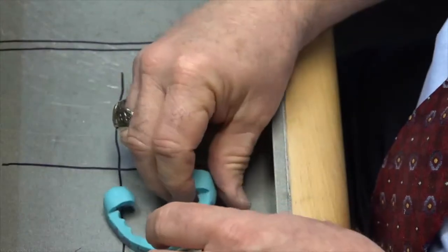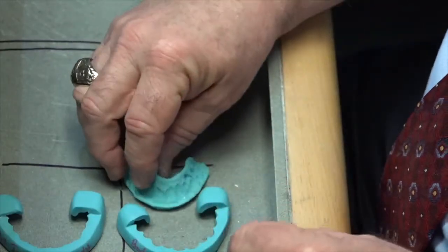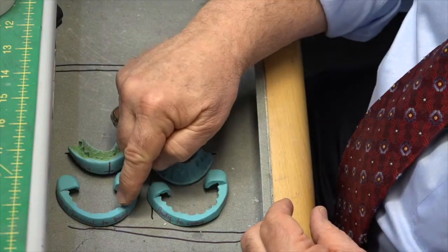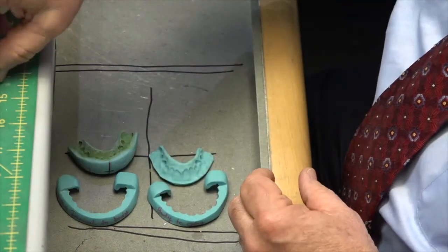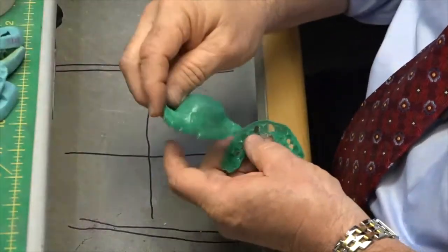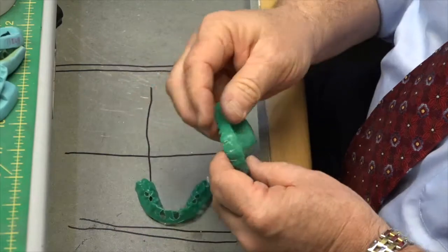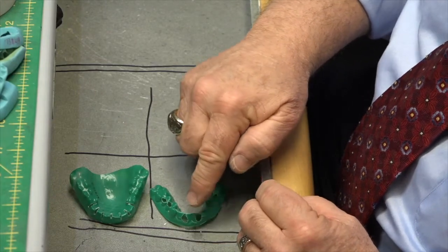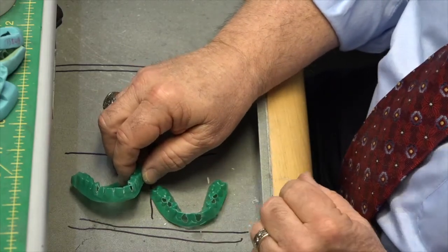What we've got with this case in finish form are our four putty matrices: the temporary putty matrix, incisal edge reduction, body-to-incisal reduction, and gingival reduction. Then before you get started on the case, to correct anything outside of the arch form, we made gross reduction guides out of the simple green sucked-down coping material. Gross reduction number one is for facial, lingual, and incisal reductions. Gross reduction number two is for interproximal slices.